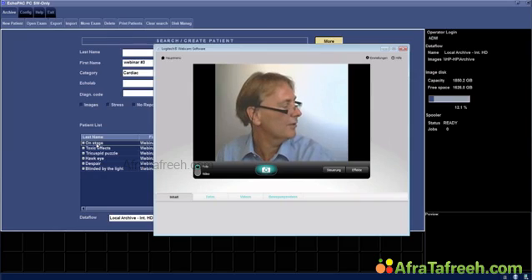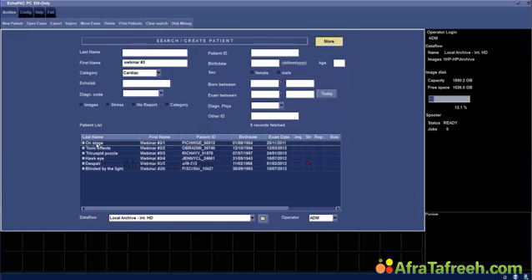And then there's another question. Pericardial effusions in case 2, not indications of dysfunction in this patient. What was case 2 again? Let me see. I forgot. Oh, that was the toxic effects.